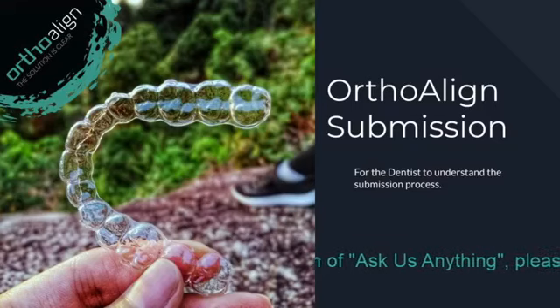Okay, over here we can see that there's a little bit of an artifact, or a bubble you could say, maybe on the buccal surface of that premolar. You can see that it's actually lifted up, right on the middle of that premolar all the way to the cervical. This is definitely going to create problems, especially for the fitment of the aligners, and of course the tracking of the aligners. It could affect certain movements of the teeth. It could also affect certain forces that are supposed to be applied to the teeth. So we want really nice clear surfaces of the entire tooth structure.